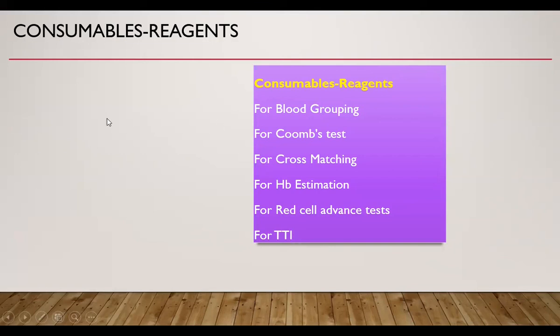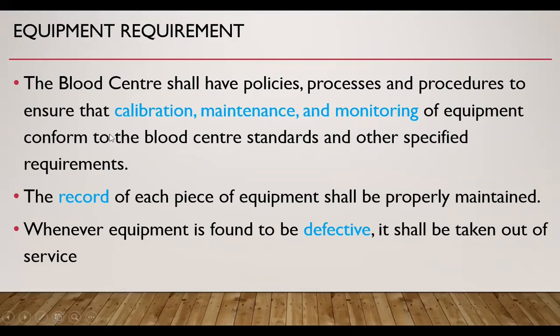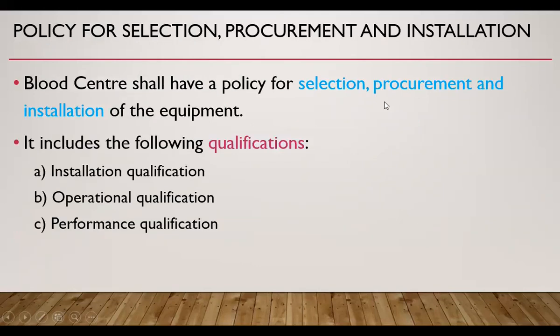Blood centres have policies and procedures to ensure that calibration, maintenance, and monitoring of equipment conform to the blood centre standard and other specified requirements. Equipment should be properly maintained and calibrated, and monitored. We should have an equipment log register — the record of each piece of equipment shall be properly maintained, including comprehensive maintenance contracts. Whenever equipment is found to be defective it shall be taken out of service immediately. The blood centre shall have a policy for selection, procurement, and installation of equipment, including installation qualification, operational qualification, and performance qualification.